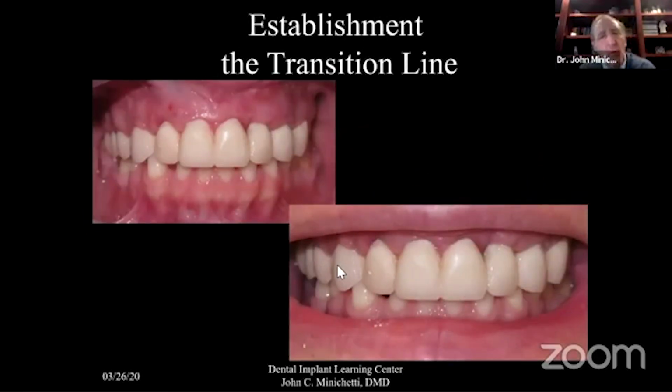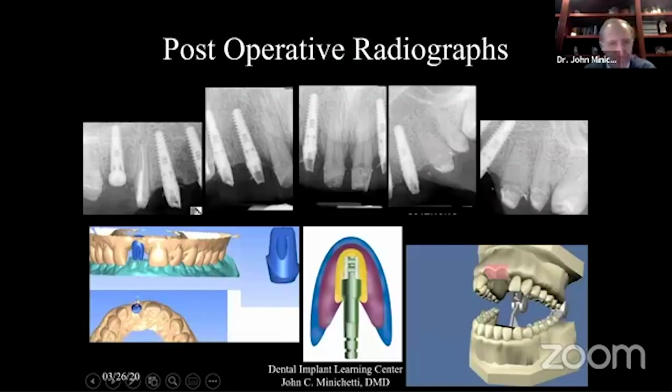So this is while she's healing a few weeks after implant placement. You can see a couple of suture lines still here. And we allowed this gingival level to heal, and then we played with it a little bit with the acrylic because, again, she has a little bit of discrepancy in the position of 6 and 7. It's a wide dimension compared to number 10 and 11.